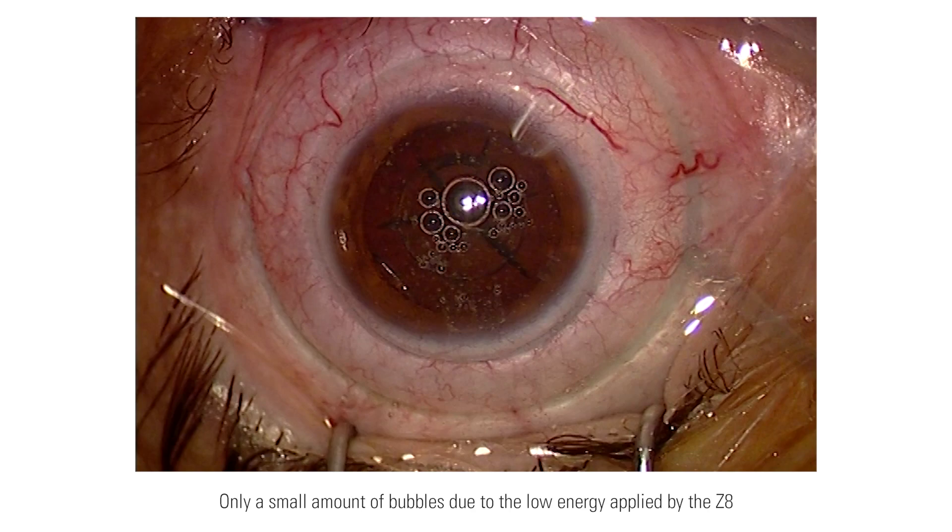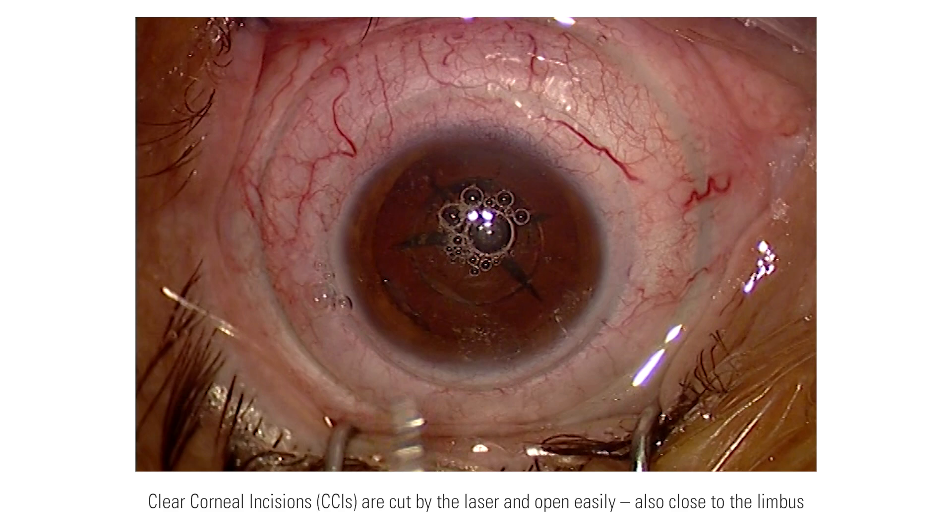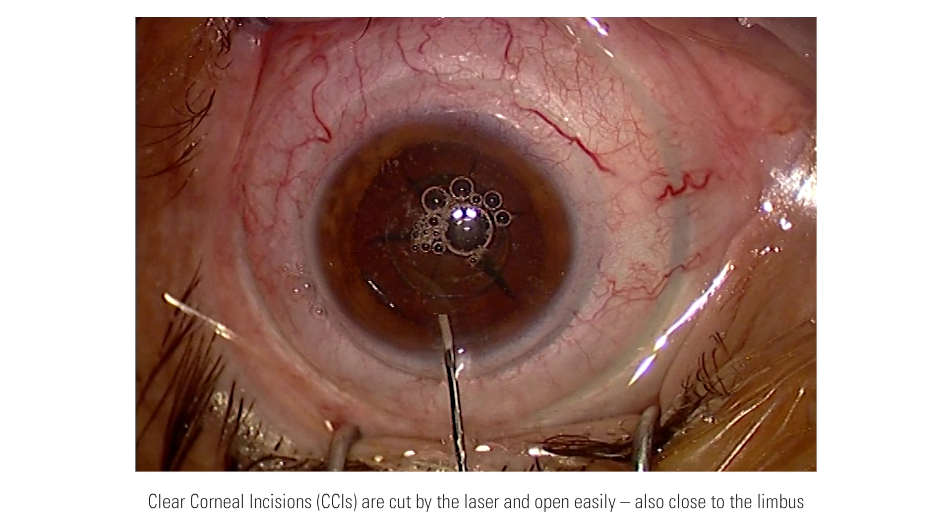Since it is a low energy laser, it creates only a small amount of bubbles, so I always have quite a clear view. The clear corneal incisions open very easily. I prefer to have them close to the limbus, and the laser is able to cut them very well in the periphery too.